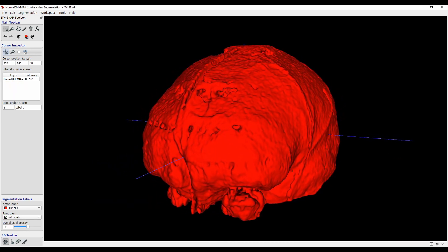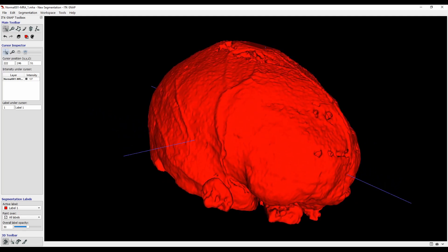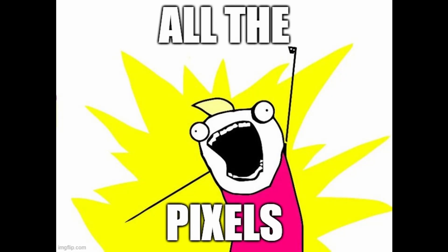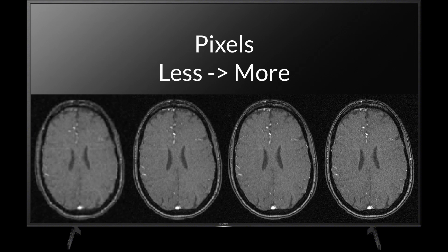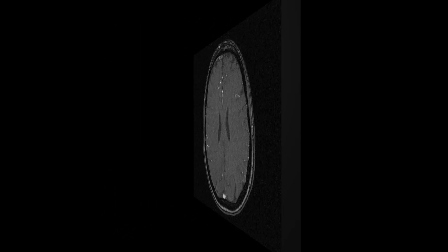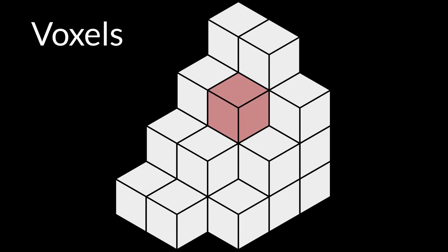Once you finish this process, you'll have a jagged 3D object that sort of represents the object you want to create. Why is it all jagged? That comes down to the scan resolution and the scan thickness. Just like your TV, the clarity of your scan data is determined by the number of pixels on each scan. But these scans also have a thickness, almost like slices of bread — so we are dealing with three-dimensional pixels, also known as voxels.